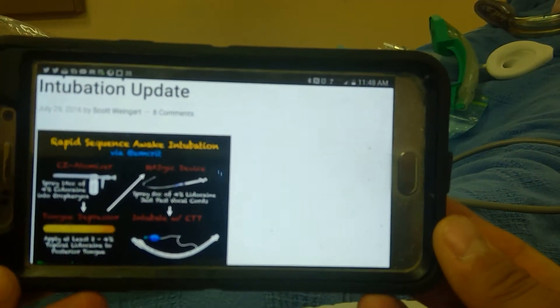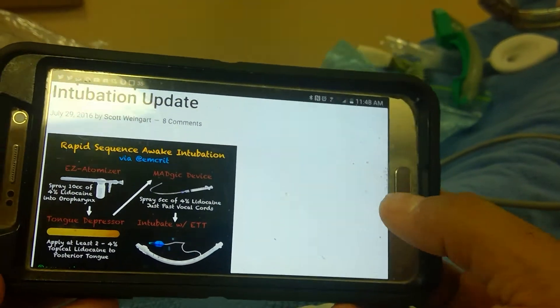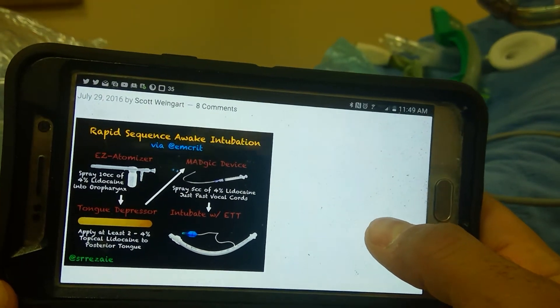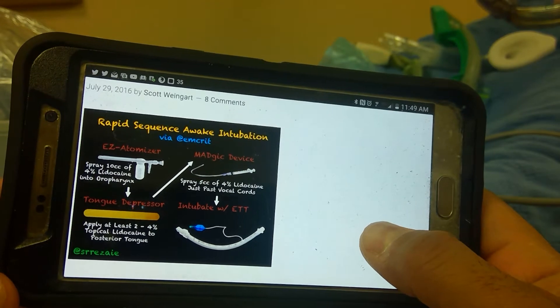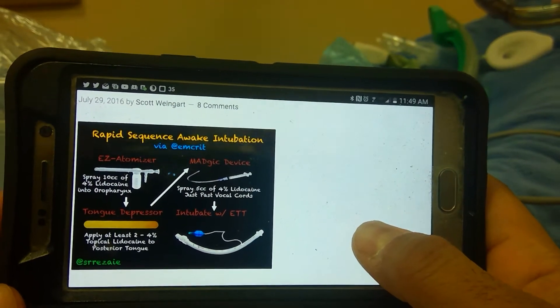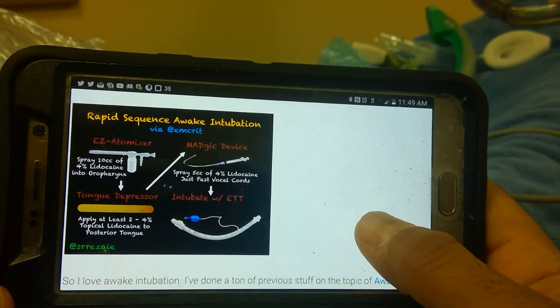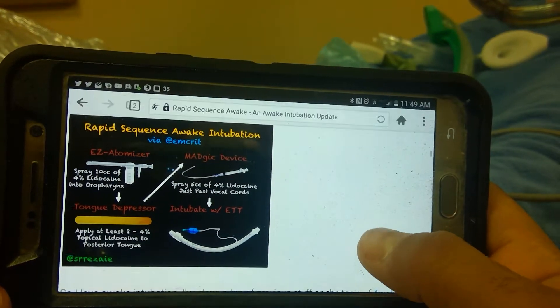Continuing the conversation — this is my project: getting a magic device, an easy spray atomizer, and getting this lidocaine that we either have in our pharmacy or order online, to topicalize patients for an awake intubation.